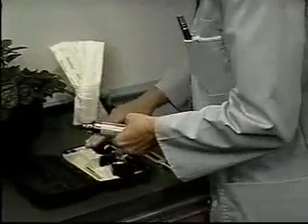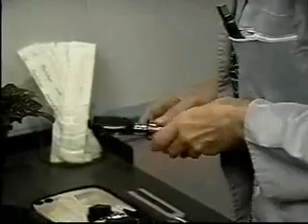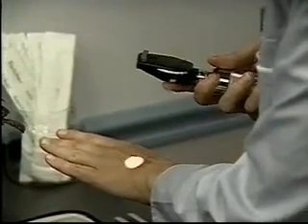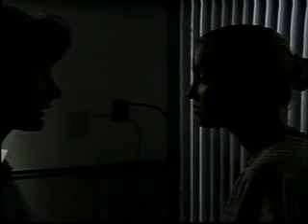When you're ready to examine the fundus, switch on the ophthalmoscope light and adjust it to the large round beam of white light. Also, make sure the light is bright enough. Set the ophthalmoscope to 0 diopters. After darkening the room, ask the patient to look over your left shoulder at a specific spot on the wall. Look over my left shoulder.